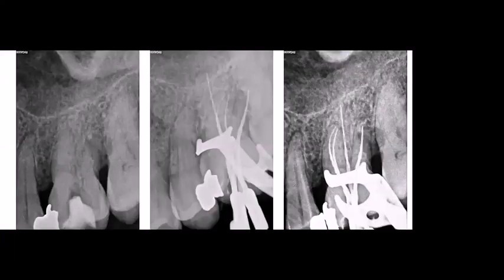For example, why are these kinds of motors very useful when we do endo? They sent me this molar. You can see that they did the access opening, but they sent the case because they didn't find the MB1. So they found the distobuccal and the palatal, but for them it was impossible to find the MB1.